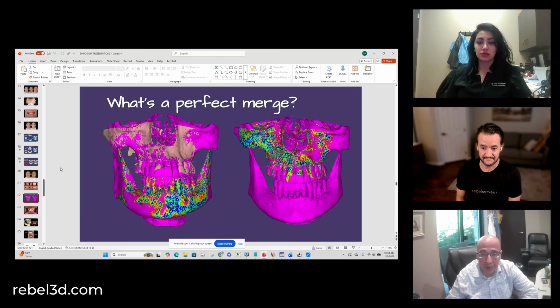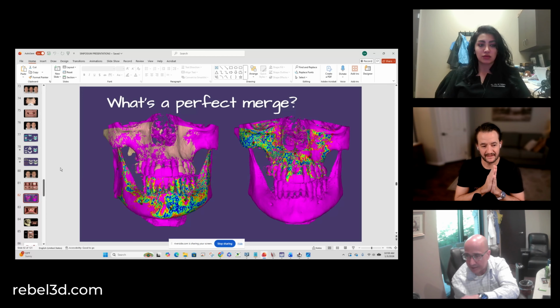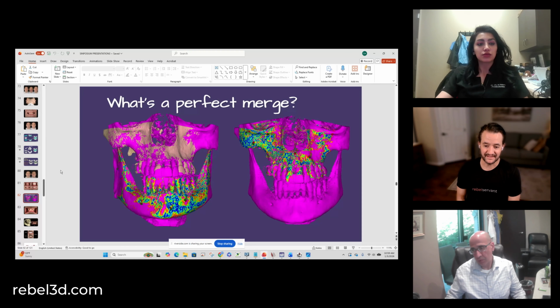And that's why, accuracy. When we do our delivery for the second day occlusion, they are glove fit. The bite, you don't really need to do too much adjustment other than slight occlusion here or there. But the bite is very accurate. You don't end up with an open bite or any of that. It's the same bite on delivery. You're completely relying on your CBCT data for your bite. Yes. You are not relying on any intraoral surface scan data for your bite. No. I love that. Makes sense.